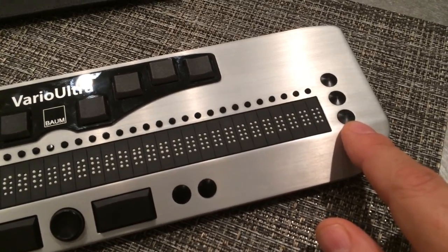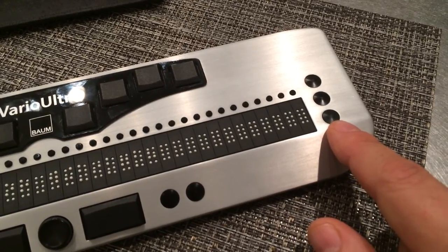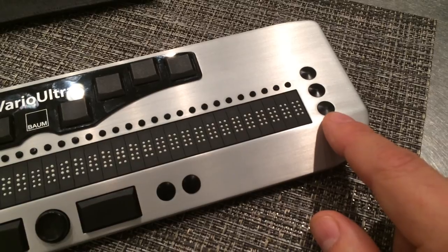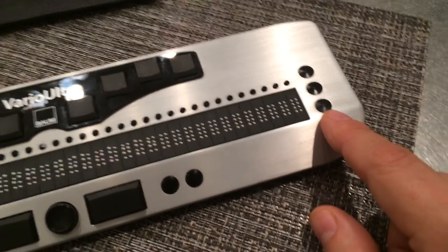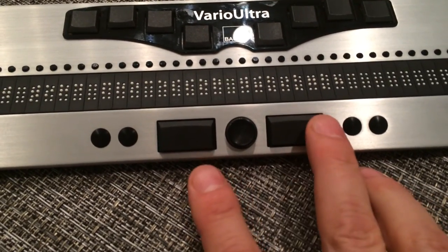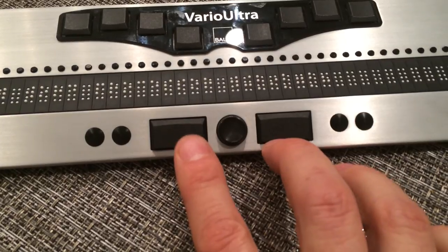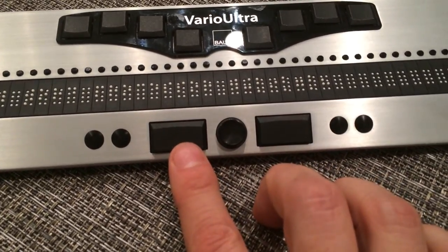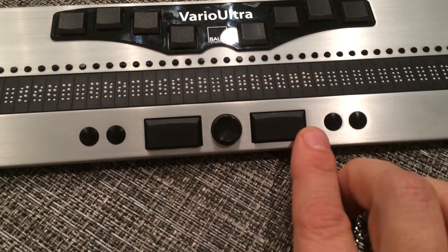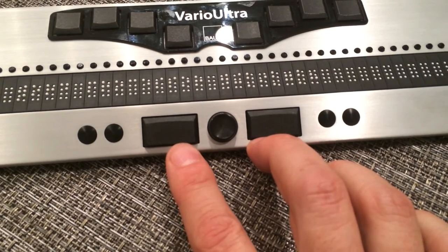These are display buttons and can be used, among other things, for navigating around a screen or navigating the display around a screen. In addition to that, there are other commands that can be used with different operating systems for accessing other features. Below the Braille display, we have two thumb keys. In Braille note-taker mode, the thumb key on the left acts as a command key and the one on the right is a spacebar. If you're using this in Braille display mode, then either key can be used as a spacebar.